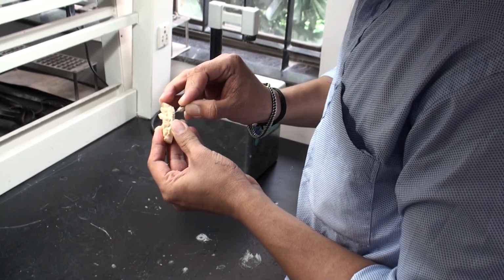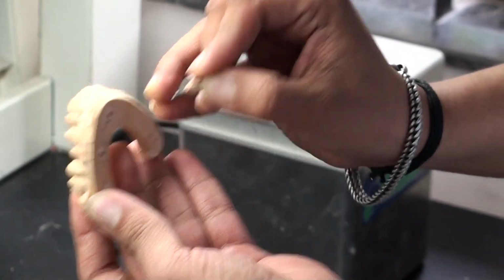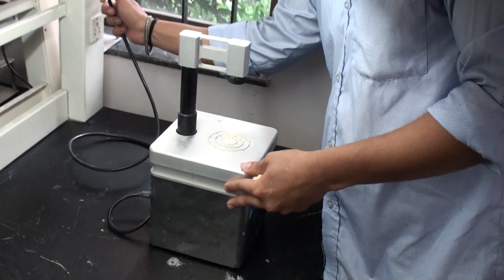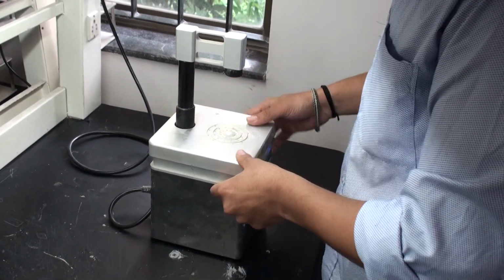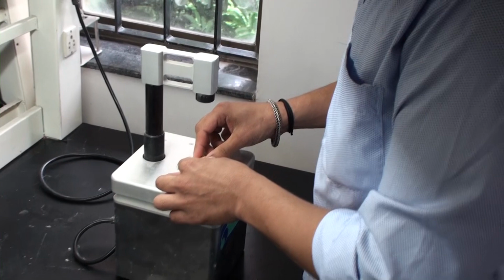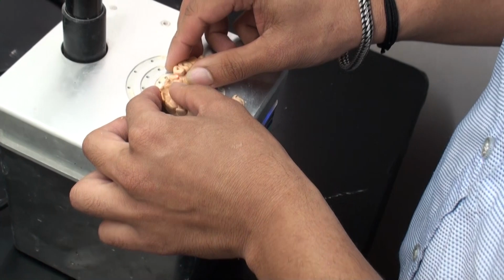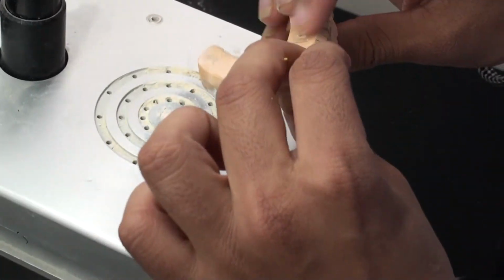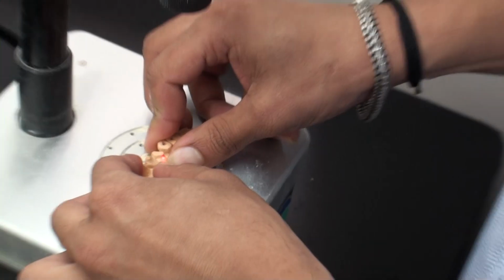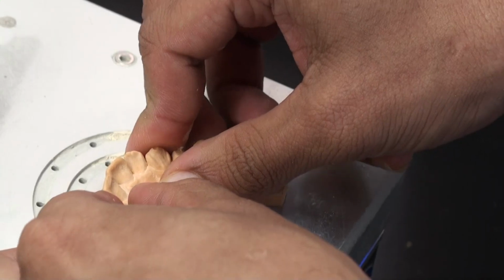Once the model is all casted up and ready, now it's time to make the dies. Now we can see we're marking with a pencil as to where the cuts need to be, and this is a pinning machine. It's getting plugged in, and you can see the platform basically goes up and down, and there's a burr on the underside of it, and there's a light on the top. That light, when it touches the part of the model, you get a corresponding hole on the underside when you press the platform below. So you can see the light comes on, he presses it, and you start getting holes at the bottom.